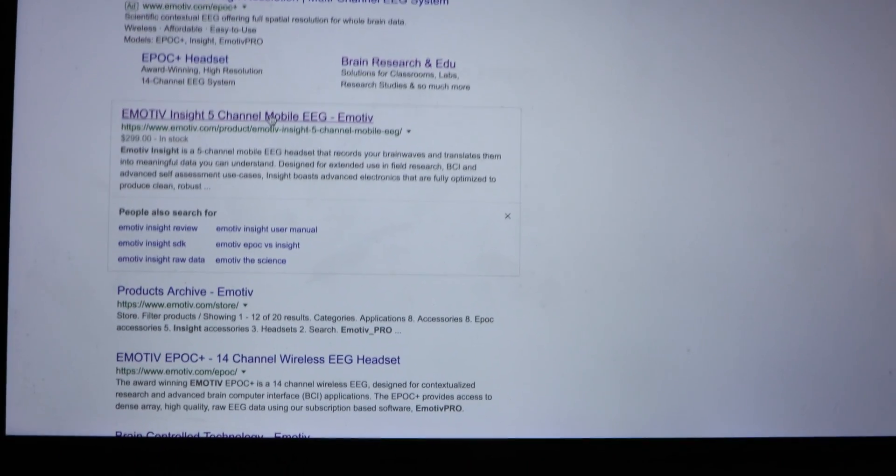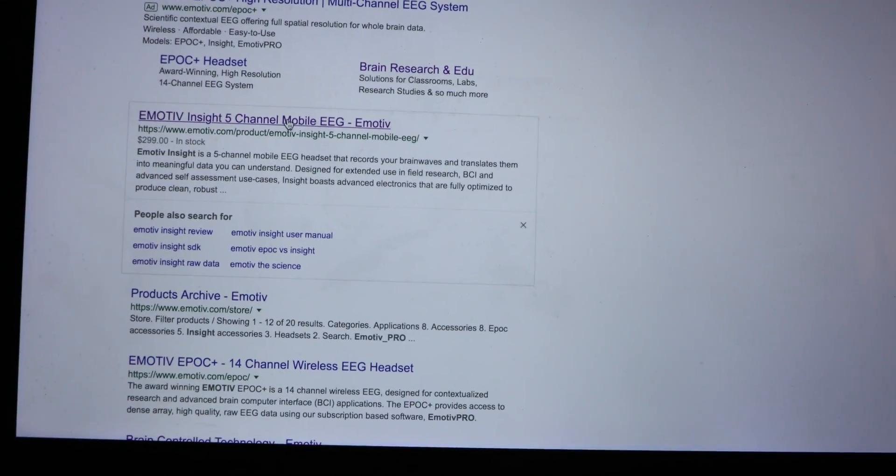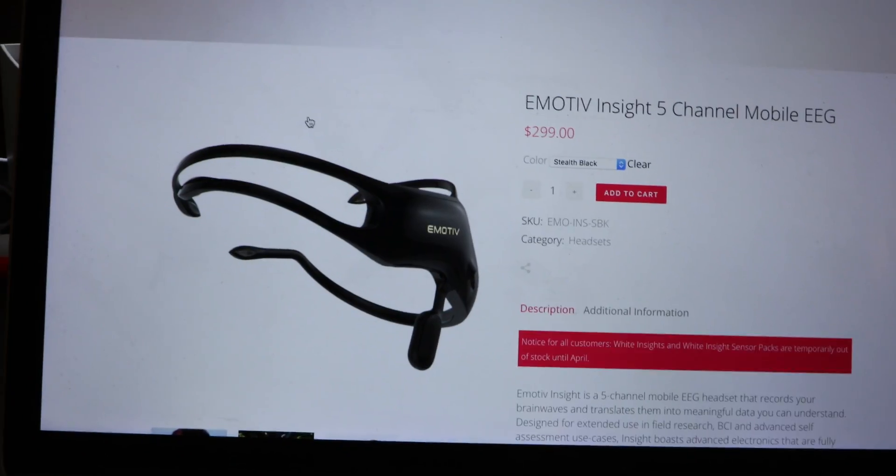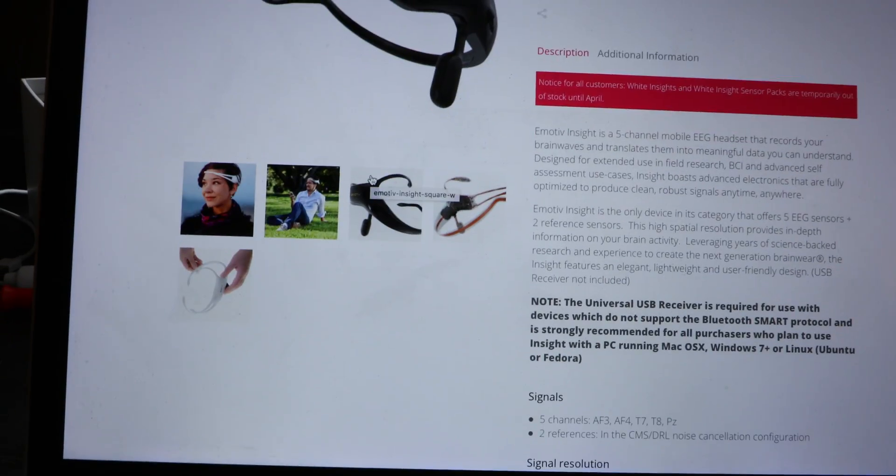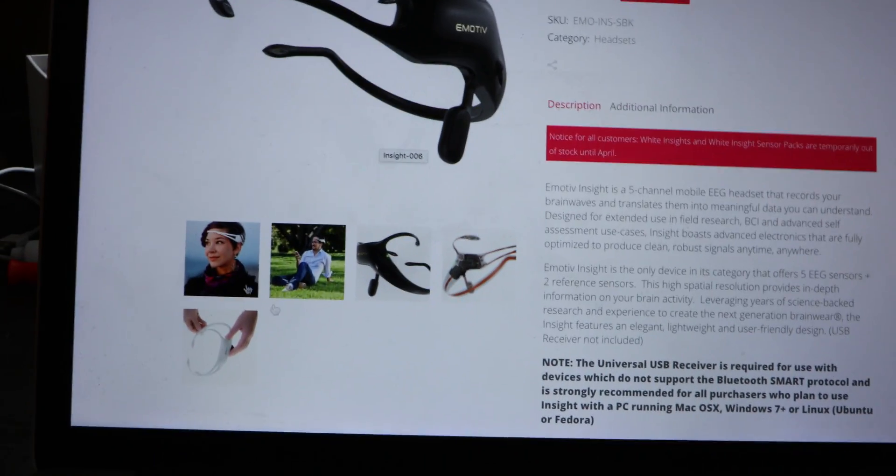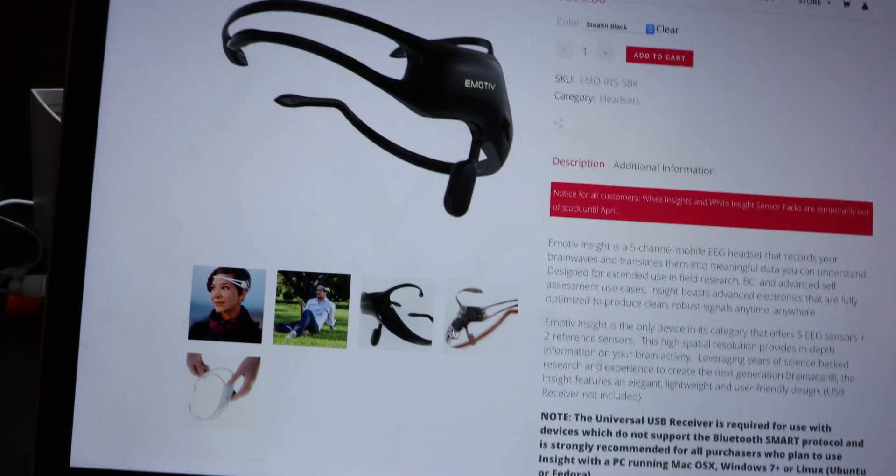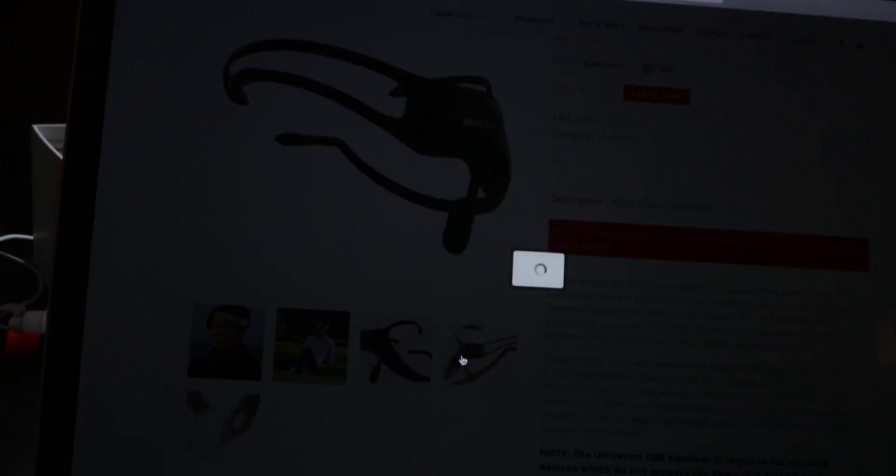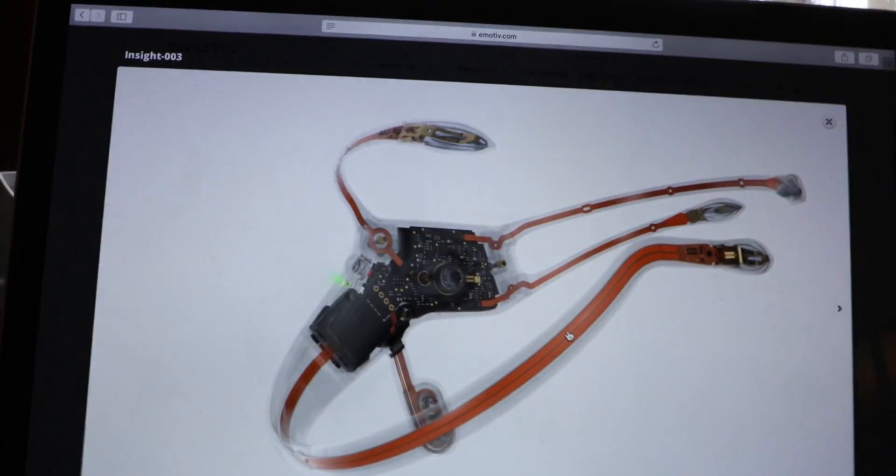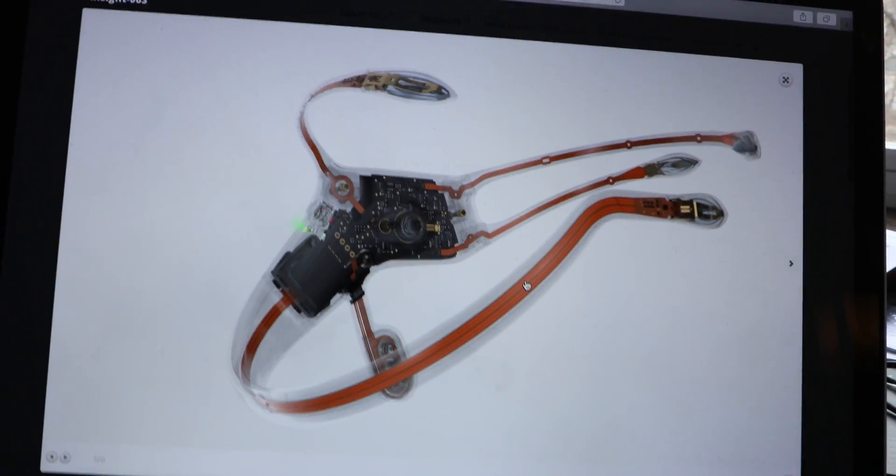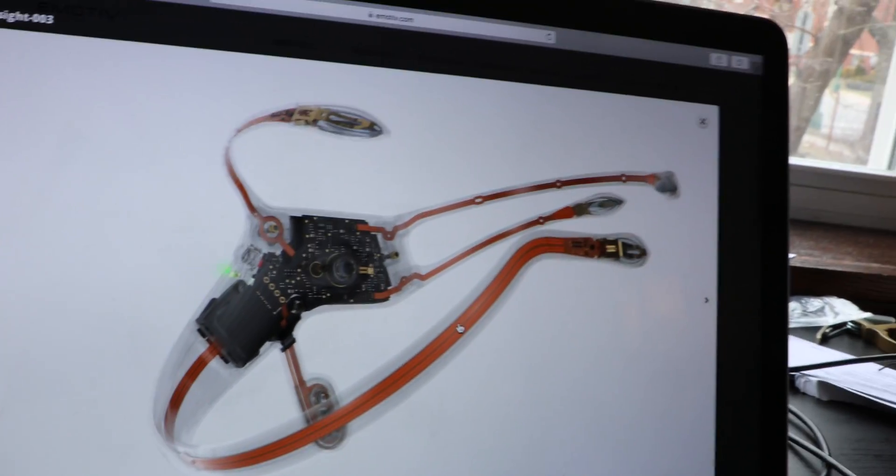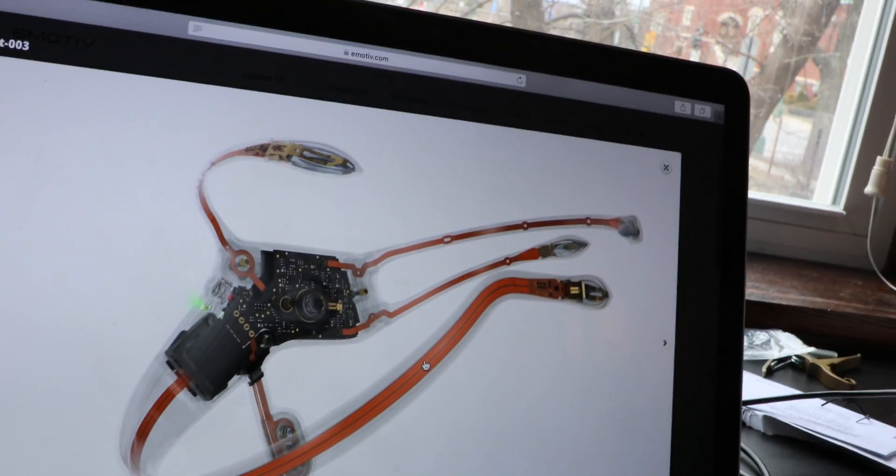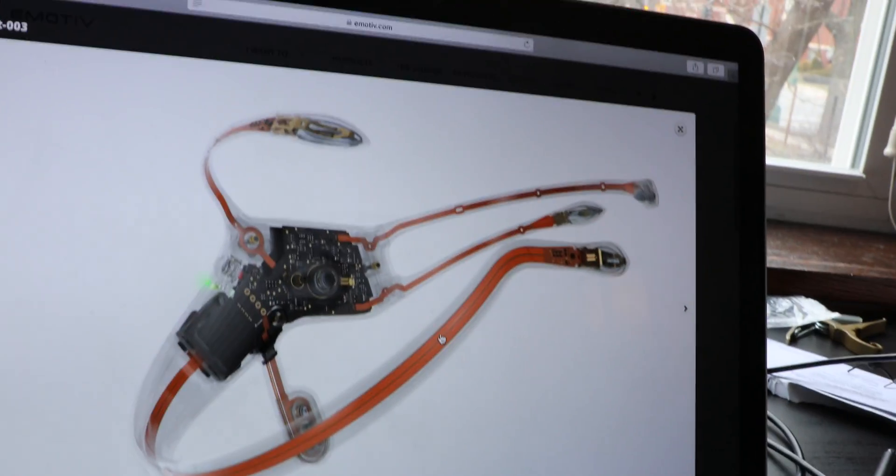So just doing a little research on the Emotive Insight before I perform surgery on it. It's actually kind of fun because on the website - just search Emotive Insight on Google - they've taken an x-ray image of the device. It's almost like we're looking at the x-ray image before doing surgery on it.